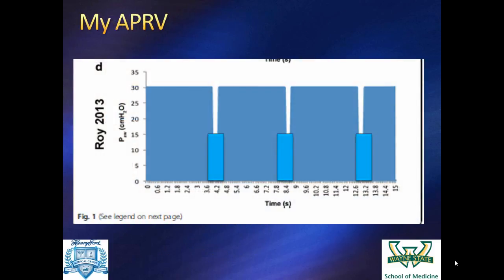So what I tend to do is say I'm going to avoid big tidal volumes, but I don't have a problem with keeping the pressures high, and as long as I can keep the carbon dioxide level okay, I'm perfectly happy to try to do this to keep my pressures high, because I do tend to think that mean airway pressure tends to correlate well with FiO2. That was shown in the ART trial, so the patients, like every other study, the patients on higher PEEPs with recruitment maneuvers definitely had better oxygenation.